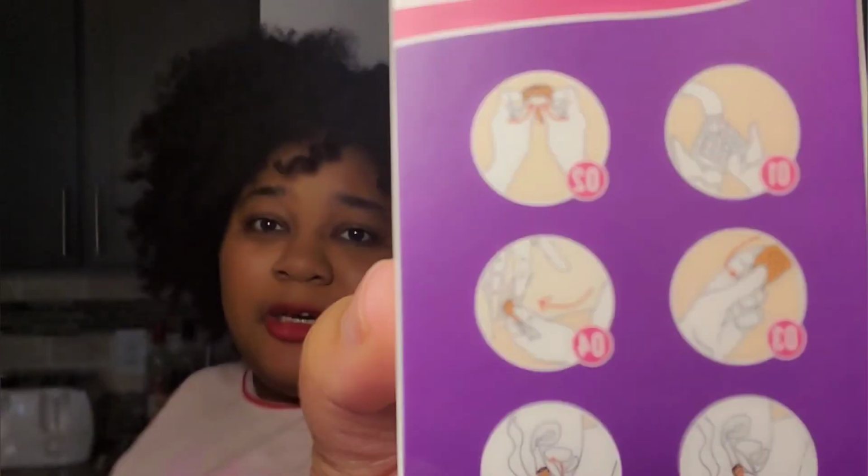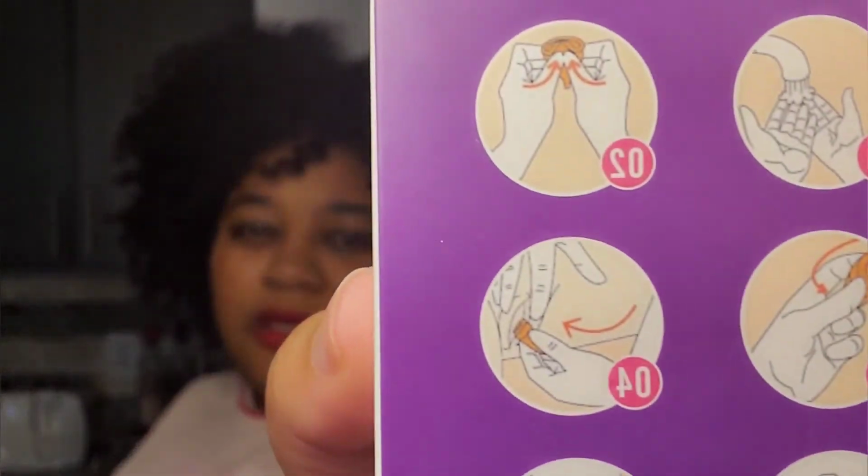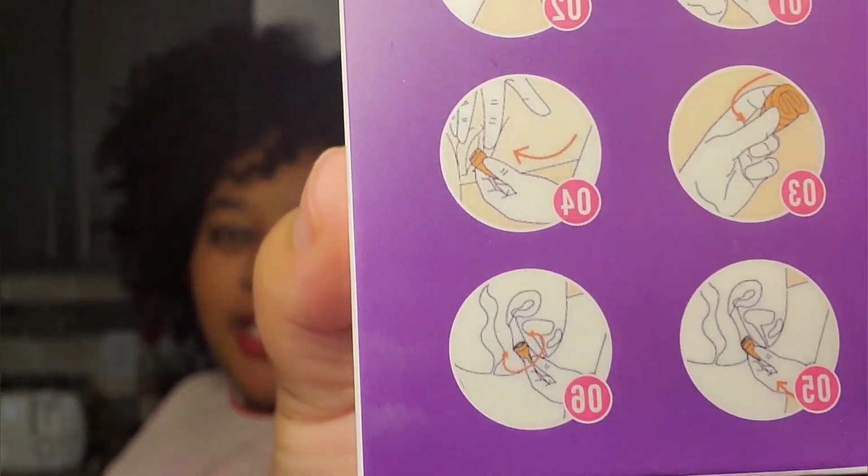So I will make a whole separate video once I get the nerve to try this again. As of now, the product is amazing. The quality is fine. It's just me learning how to insert it. I'm going to read these instructions again, figure out how to fold it and roll it, and, yeah, maybe I just need to be a little more forceful once I get a lubricant. But you can see that: wash your hands, fold it. Come on, focus. Fold it again, insert, and so on. So, first attempt, fail, but I'm going to try again.